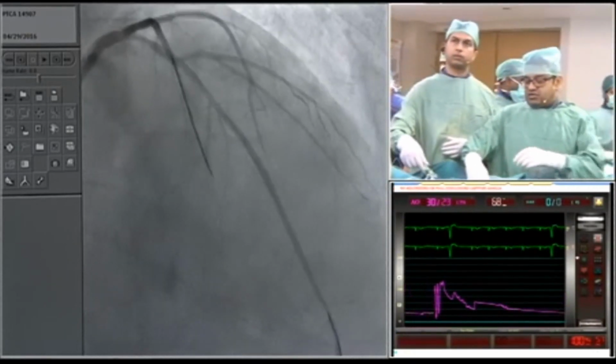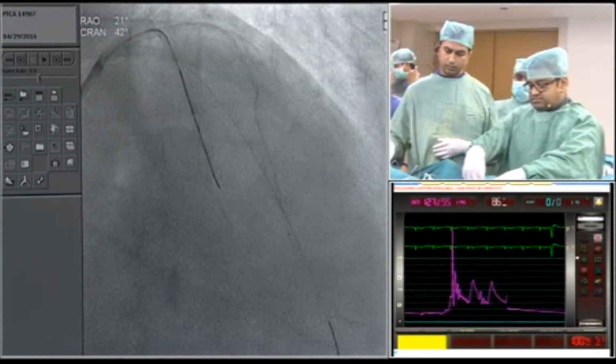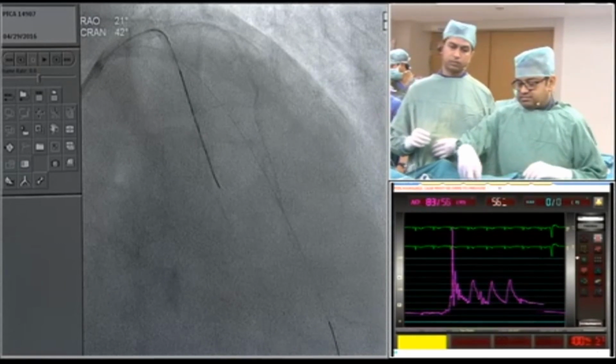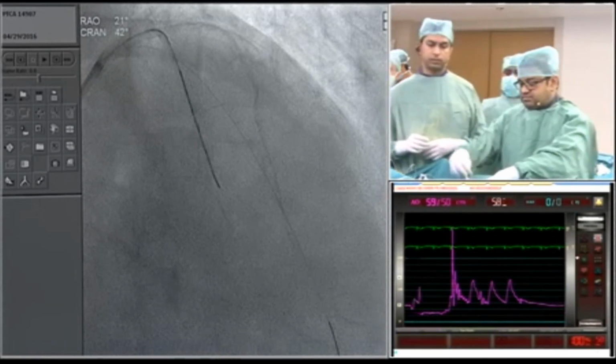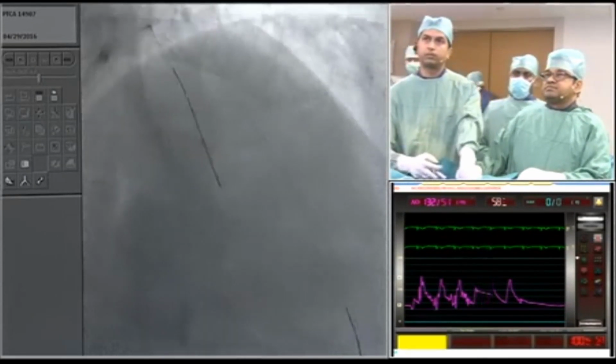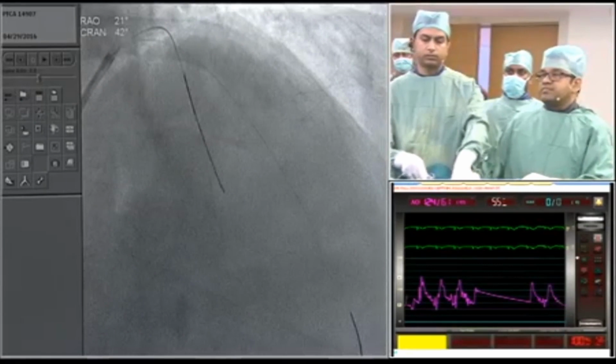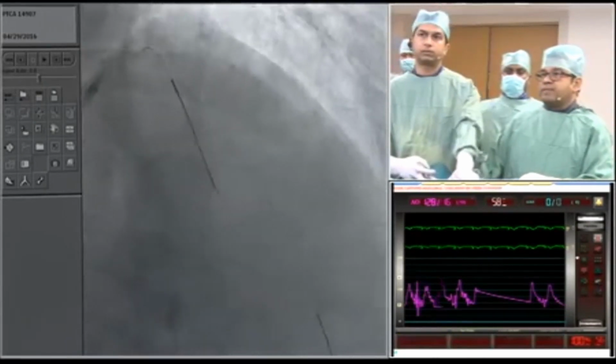So you put the stent on. Would you cover the whole left main, or would you come... Bigger than 4. I mean, you could stent from the left main into the LAD.